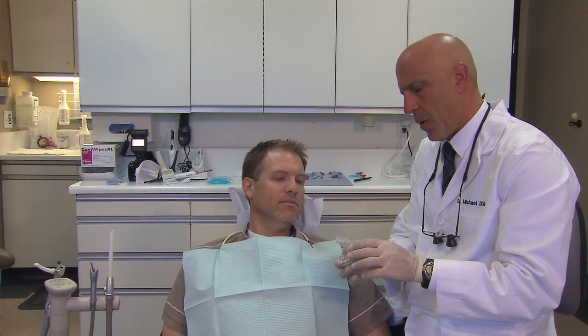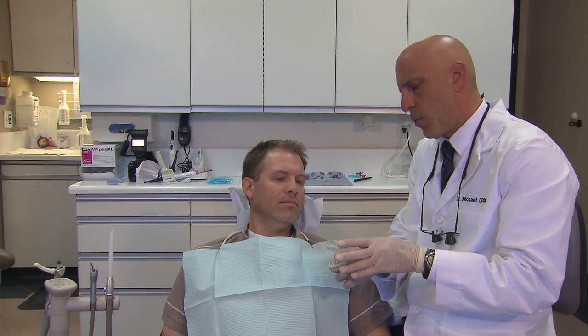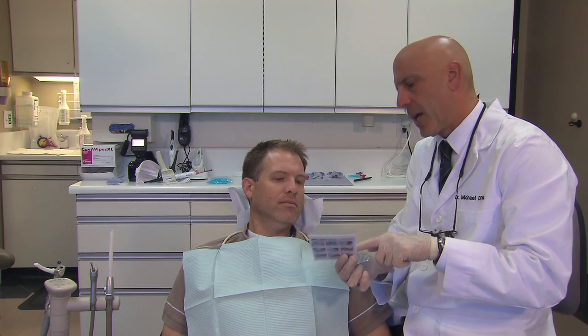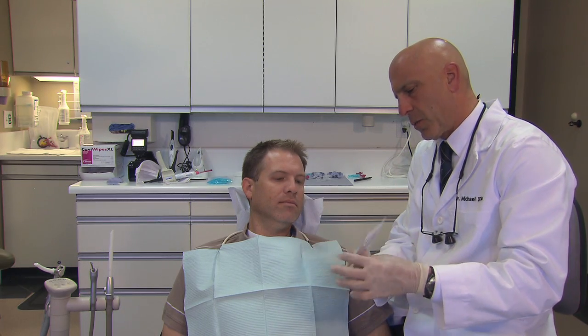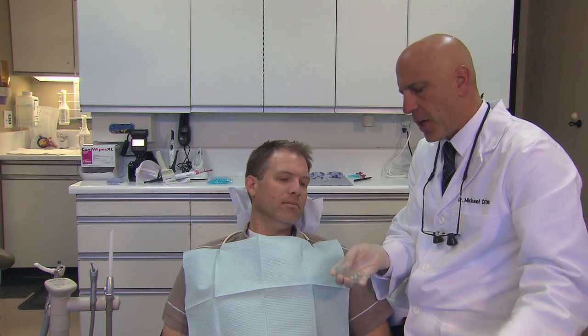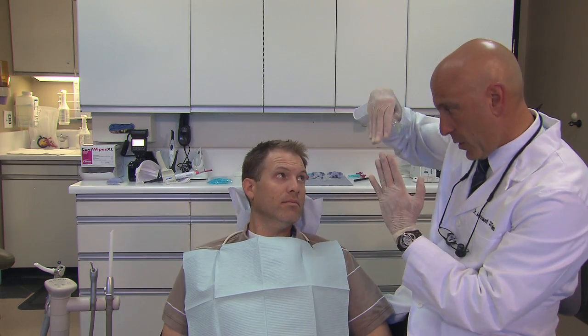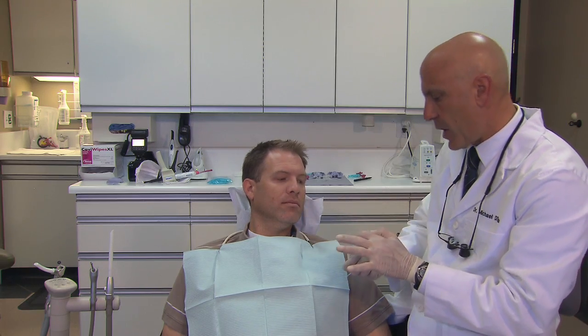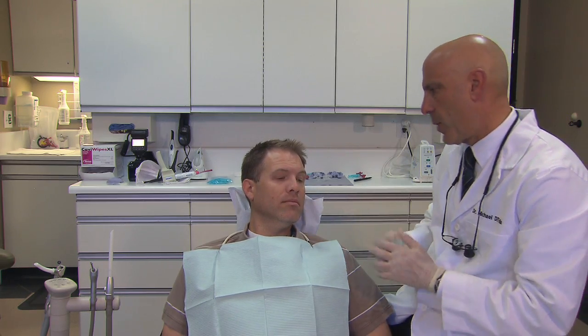And then we spend a little time talking about how to change those straps. If after whatever period of time you pick, let's say, 5 nights, they're still snoring, he can go with a little more anteriorization. So patients' questions get answered, we deliver the appliance, and then we wait to hear back from them as to how effective the appliance is at this current setting of anteriorization.